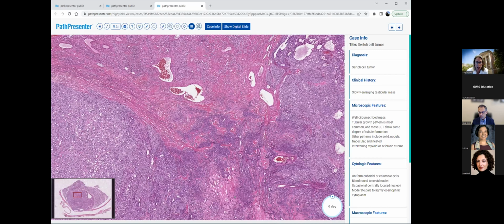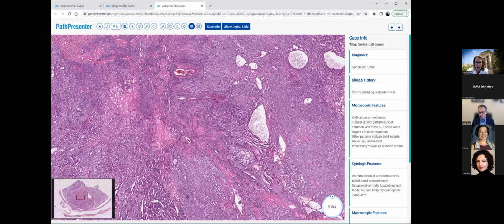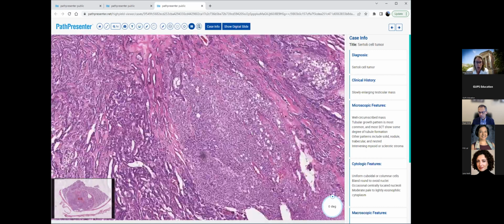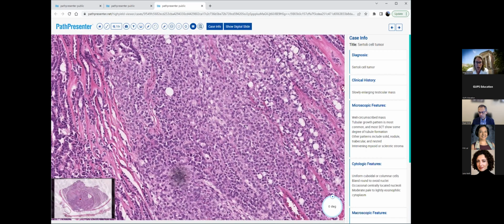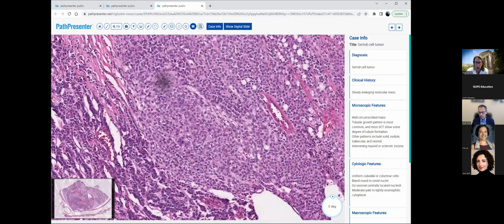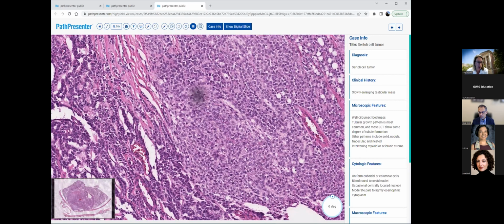Those are pretty rare, but usually the combination of some amount of tubular growth pattern and these fibrous bands is going to be your hint that these are of Sertoli cell origin. Other things you can point out about these Sertoli cell tumors: very bland cytology. These are very monotonous, small nuclei, round, single nucleolus. Effectively, each cell looks like its neighbor. Very little pleomorphism here.